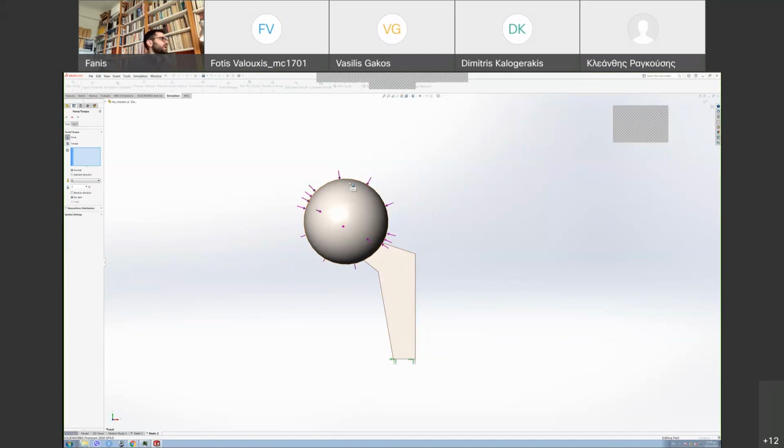So we're gonna use this now. Just put select direction here so it's not normal. And now you need to select the direction, just select the vertical direction. It goes up, okay, then just click reverse direction.